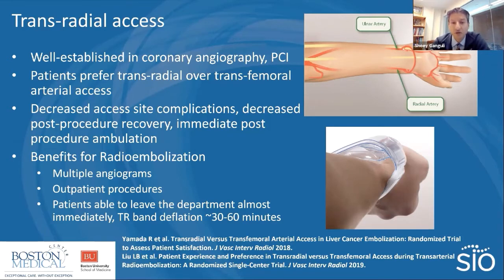We're doing multiple angiograms, multiple interventions, so it gives us another site for access. These are outpatient procedures. I leave my TR band up for about 45 minutes and take it down. And so if you're not doing post-procedure imaging, patients can leave the department almost immediately. So it really helps with the throughput of the patients.